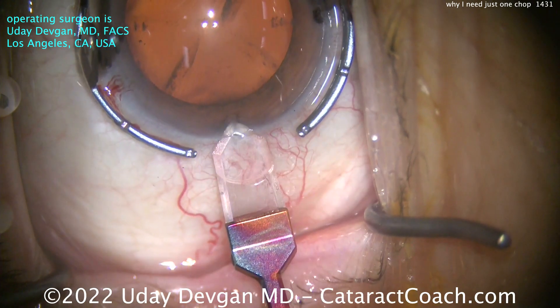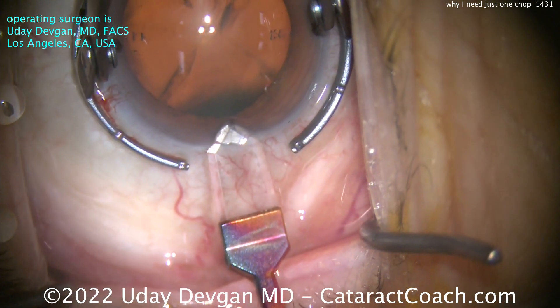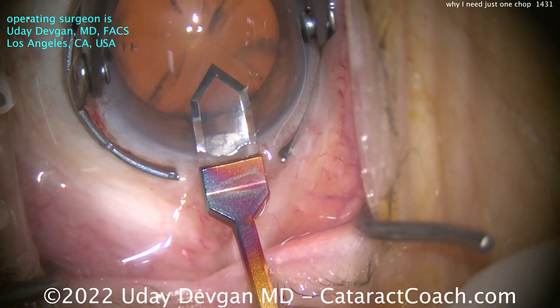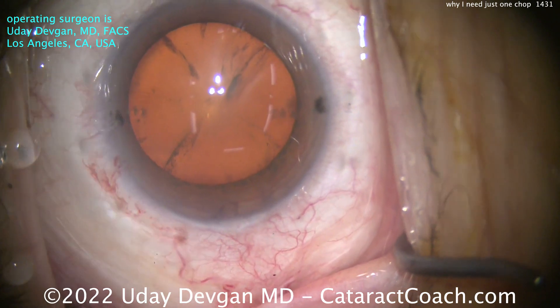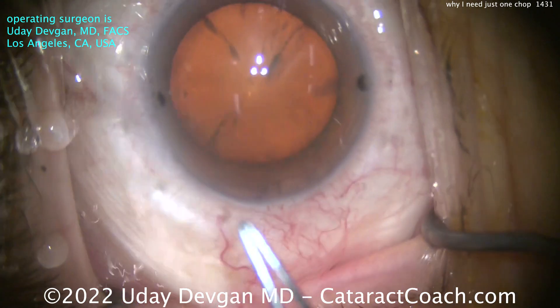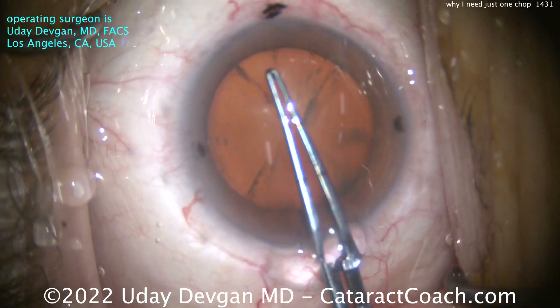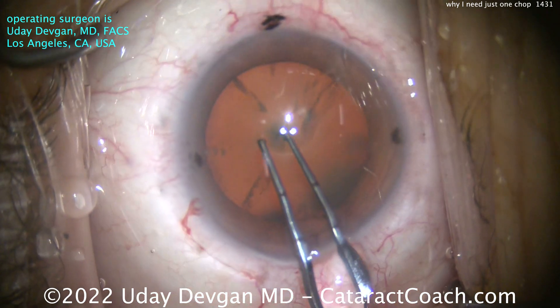The first thing we're going to look at is the nuclear density. This patient has a typical nuclear density for our Beverly Hills Clinic — about 2-plus nuclear sclerosis, maybe 3-plus. This technique of just one chop works great for that density of nucleus.